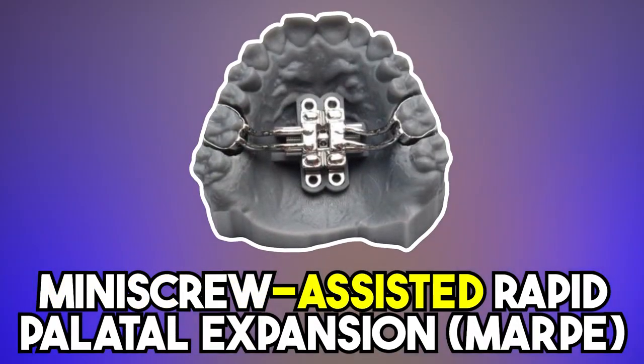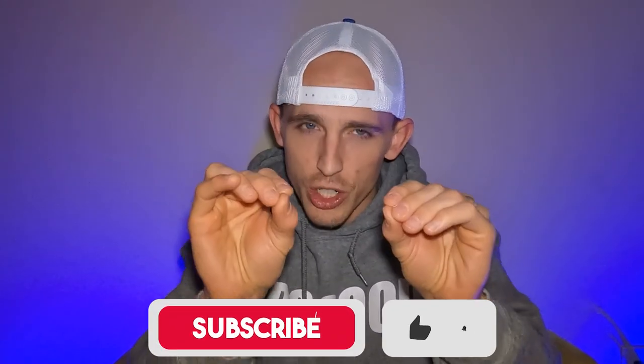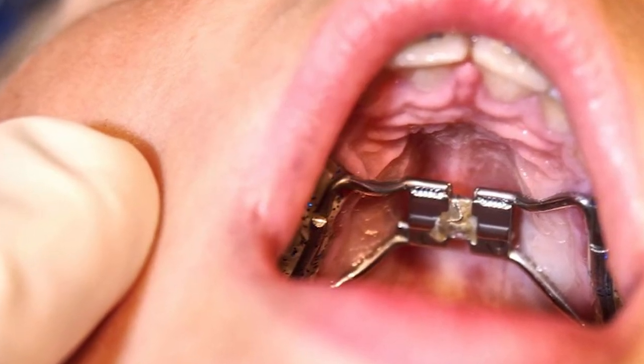There's a technique called MARPE — mini screw assisted rapid palatal expansion. That means that you stick two screws, temporary screws, into your bone. They eventually come out and we build the expander on top of those screws. So it's locked into your bone and it pushes your teeth apart. We're going to react to this video to show you about how it might work.